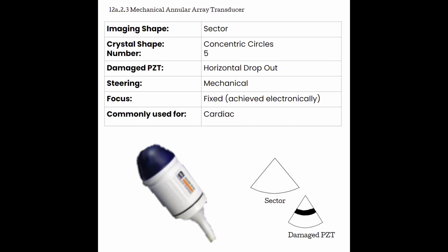So the really awesome part about the annular array transducers is that it has amazing lateral focus, because each of those crystals down the image is going to have its own focal point, but the temporal resolution really suffered because we needed to send out 4, 5, 15 pulses for one scan line. Surprisingly though, this was still used mostly as a cardiac transducer, again because of its small footprint, fitting in between the rib spaces and the type of image that it created.